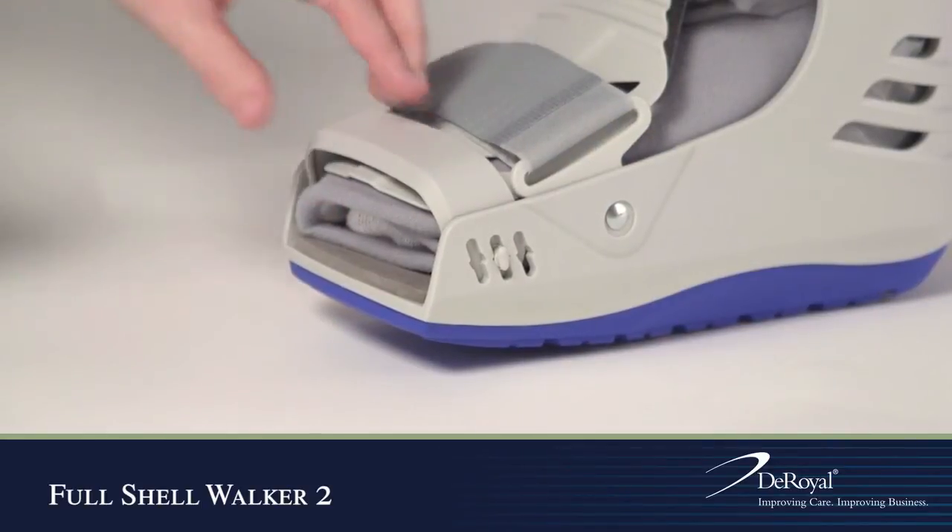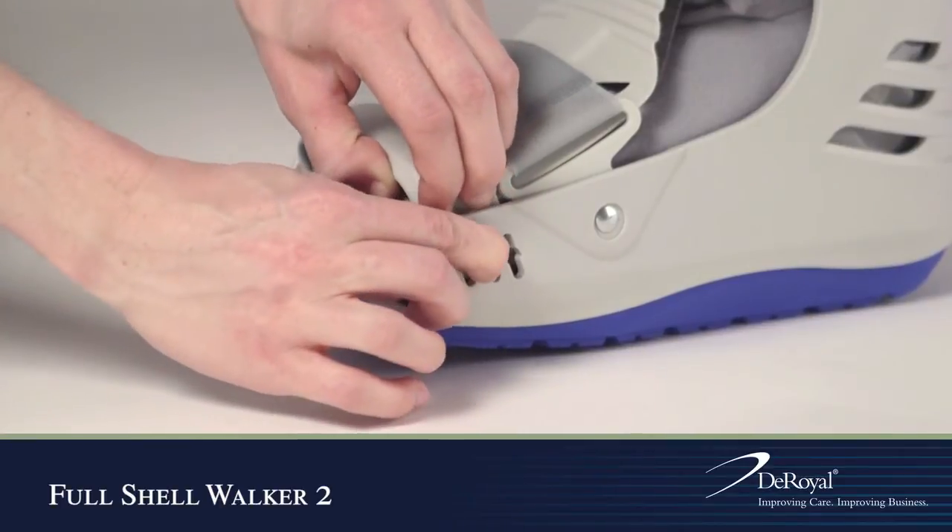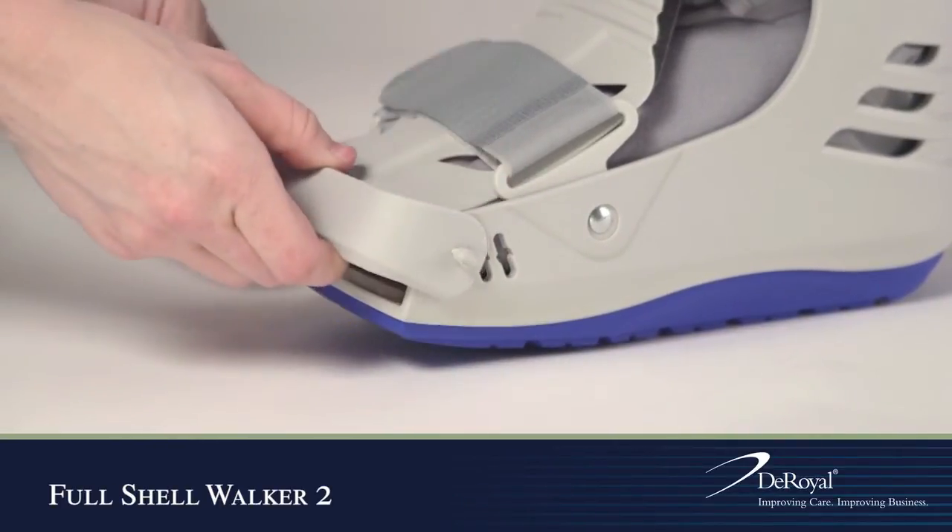The DeRoyal Full Shell Walker 2 also features a unique plastic toe guard that can be repositioned or removed as needed.